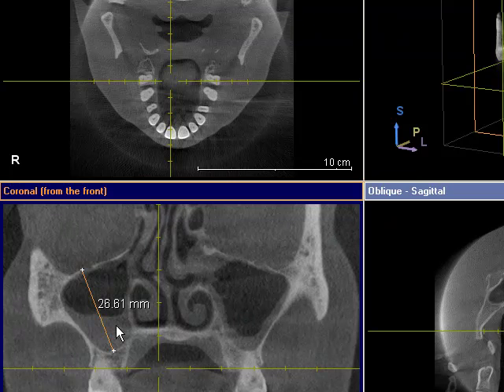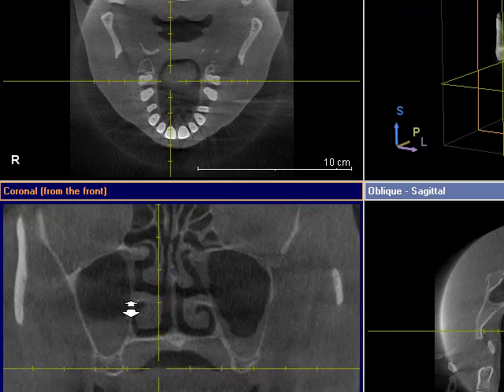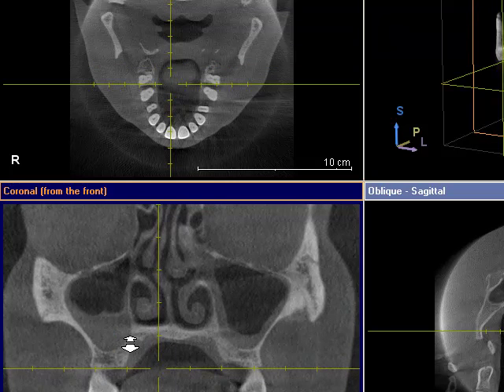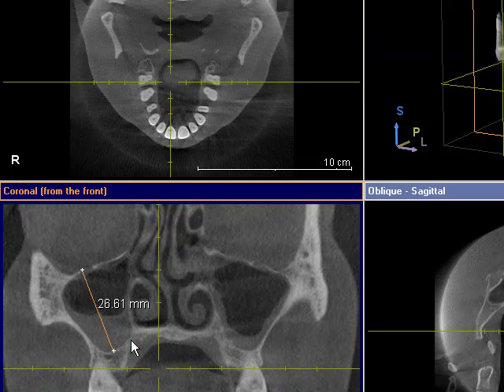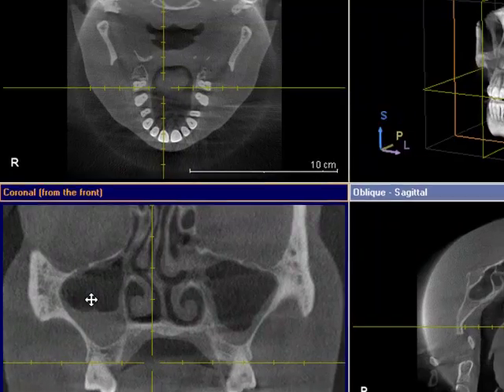That's only one-to-one so that's a true measurement. You can still scroll through this volume and your measurement will appear once you get back to that area, as you can see just here. If that measurement is not needed or incorrect, just hover over that measurement until you see the four-headed arrow, and then press the delete button on your keyboard and it will disappear.